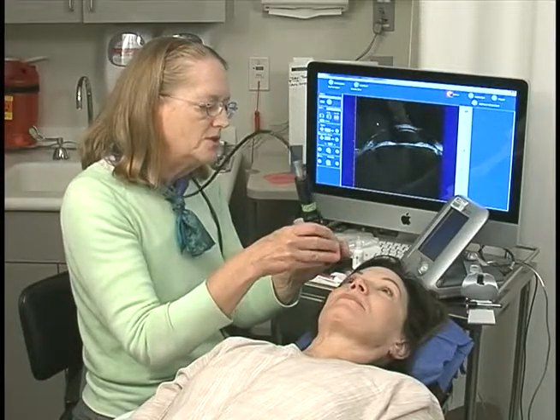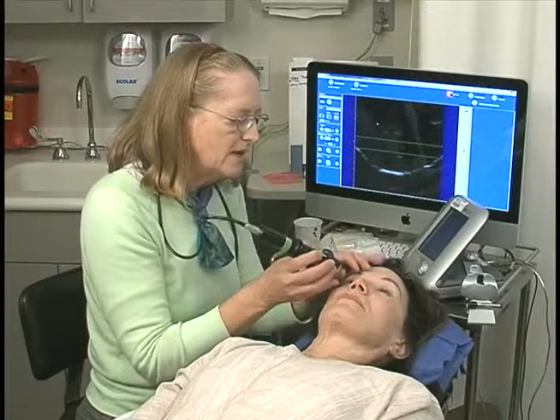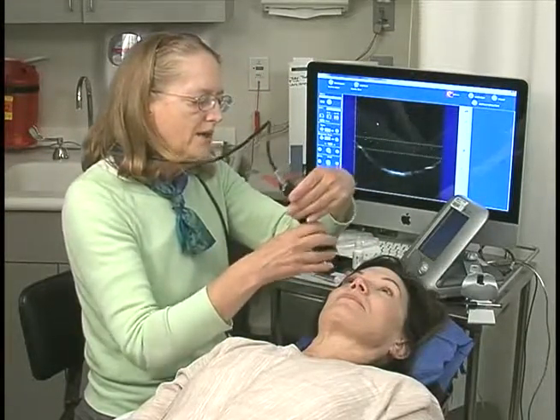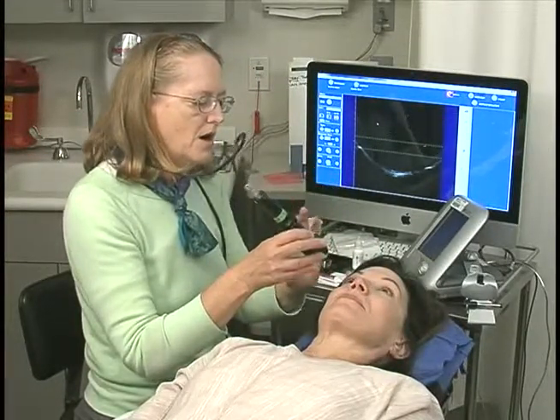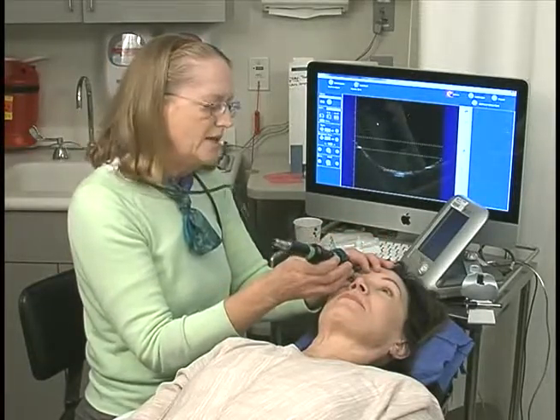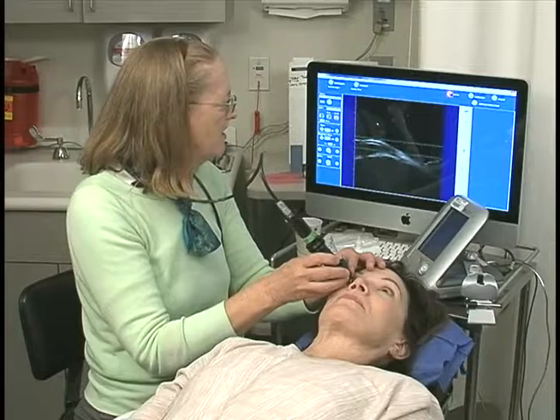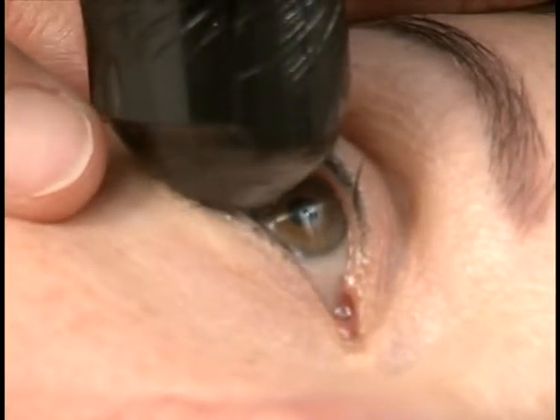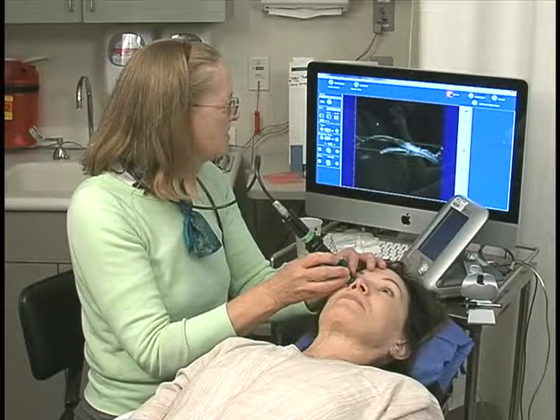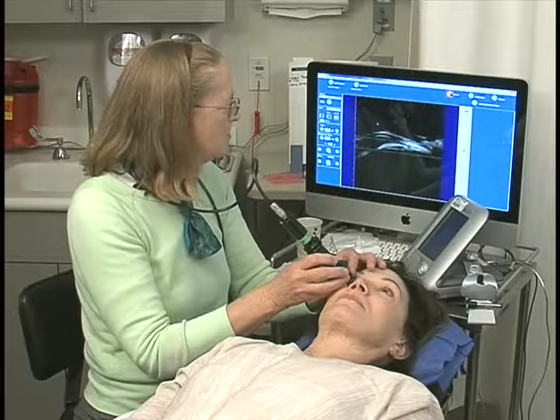When I'm looking at the angles, what I might do is go to more of a radial scan. I like to put the marker away from the pupil so that my scan will look like that. My job again is to put the area of interest into the focal zone.